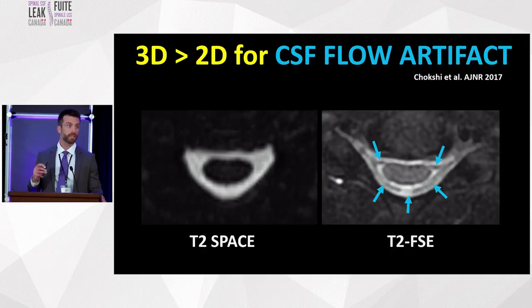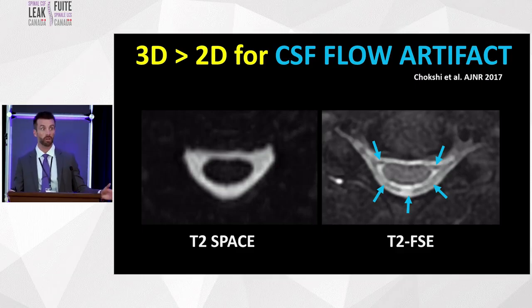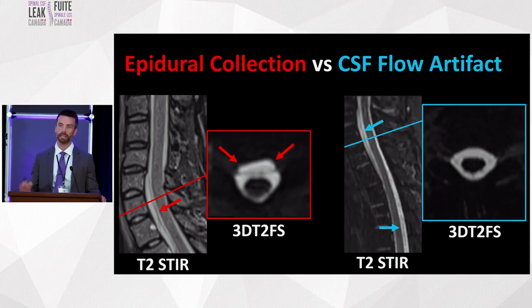Number 1, there are these CSF flow artifacts, these little black lines that, to any radiologist in the room, you would look at the screen and see those black lines and you just look through them all day. It doesn't bother you at all. There's no problem in terms of other diagnoses. And our 3D imaging gets rid of those lines, right? And it's not just that we make a prettier image, but it actually can cause diagnostic problems.